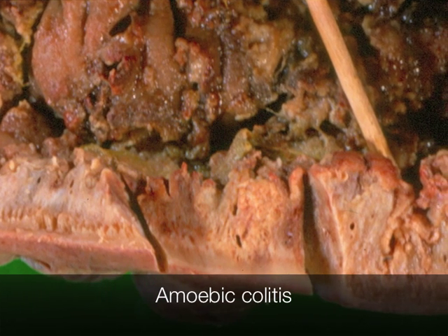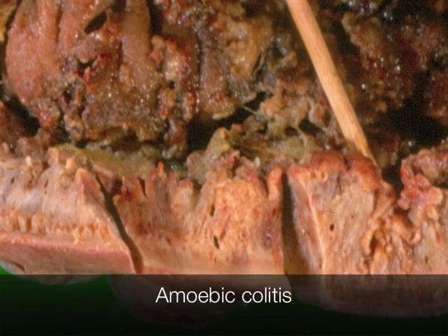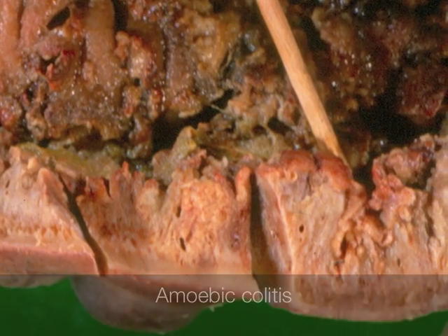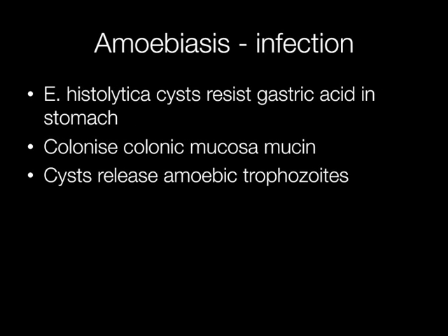This is a segment of colon that shows features of amoebic colitis. The amoebae enter the gastrointestinal tract as cysts, and the cysts resist gastric acid in the stomach, allowing them to pass down into the colon where they colonise the mucin on the colonic mucosa. It is here that the cysts release the amoebic trophozoites.